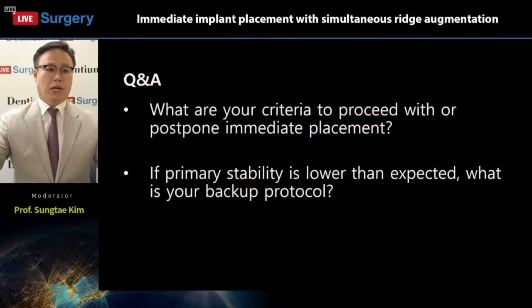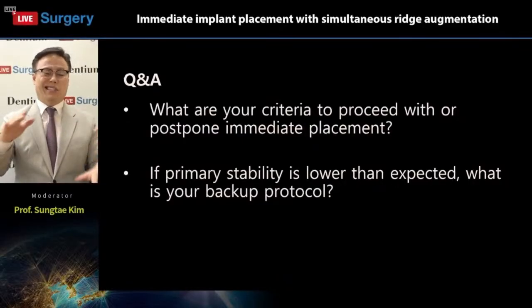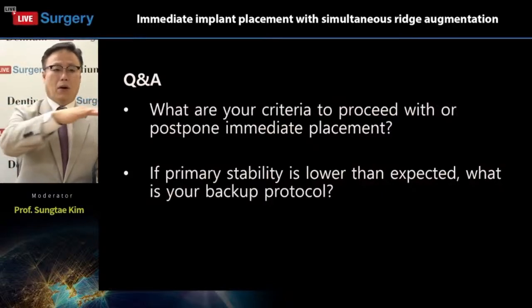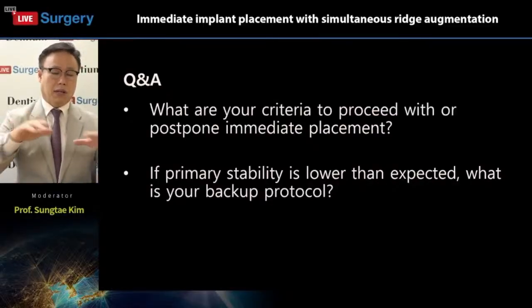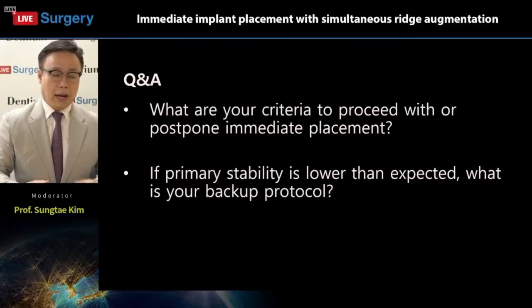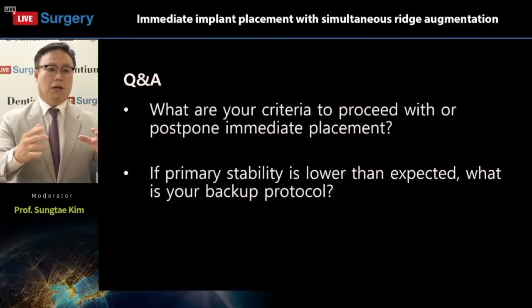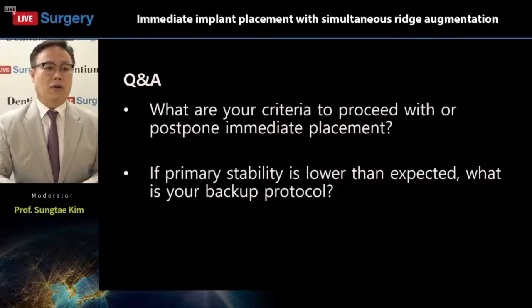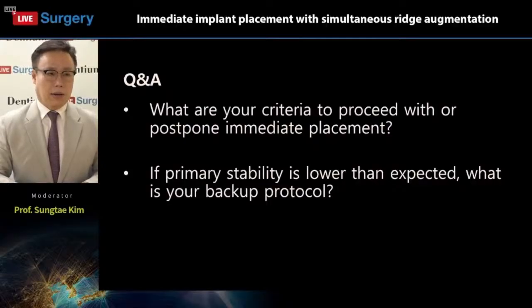If there's too much inflammation in the extraction socket, we cannot expect exactly where the final level of the crestal bone will be located. We cannot expect it if there is a lot of inflammation. And also, if there's a lot of inflammation, it's unpredictable. Sometimes, even though we place the implant, it increases the rate of failure. So in that case, we postpone the implant later.